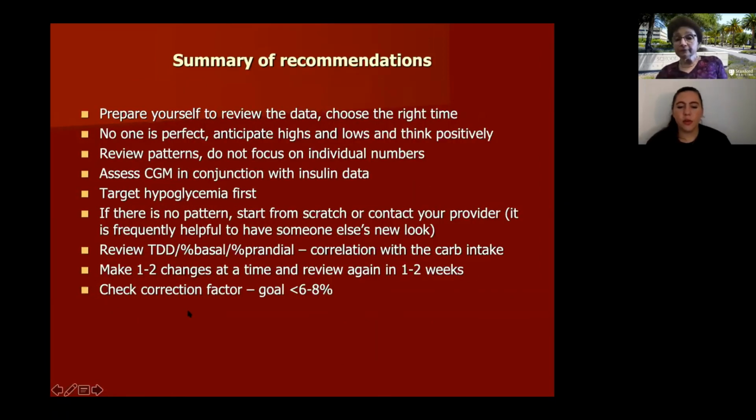Do those sites go away, or are they permanent? It takes a long time, years, to go away. So they're not going to go away in a week or a month. Yeah, it takes a long, long time. But use those sites for the CGM. Actually, sensors work a little better in the hypertrophy sites. So use the other sites that you're using for the CGM for infusion sets, and use those sites for your continuous glucose monitoring.